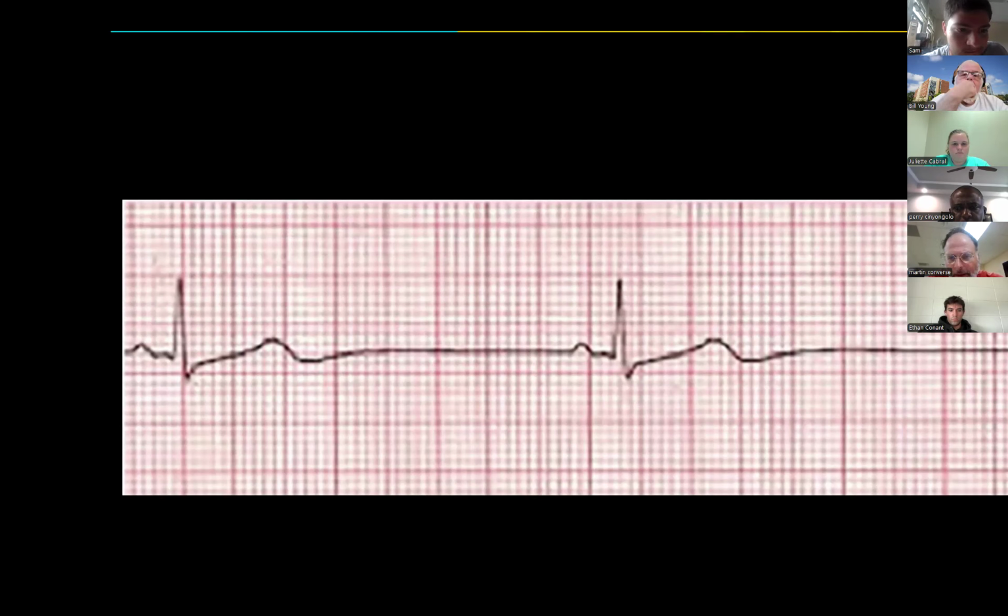It looks like it's about 4 boxes to me. Okay. Is that normal? Yes, that'd be normal. Absolutely. So, there's rarely going to be a hard and fixed anything within medicine, but definitely within these measurements, that's going to be something that we're going to begin to look at. So yeah, you're exactly right. That is going to be the upper limit of normal.